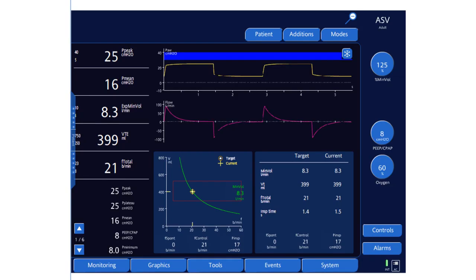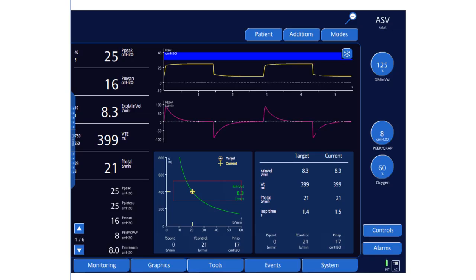The target is 8.3 liters per minute, delivered at 21 breaths per minute with a tidal volume of 399 ml. The patient is not breathing at this point, so everything is PRVC. The control rate is 21 breaths per minute, and the pressure required to deliver this tidal volume is currently 17 cmH₂O. Peak pressure is 25 (17 + 8 PEEP), leaving only 5 cmH₂O of headroom. The safety box limits the tidal volume above and below to avoid hypoventilation and barotrauma, with rate limits of 5 to 60 breaths per minute.